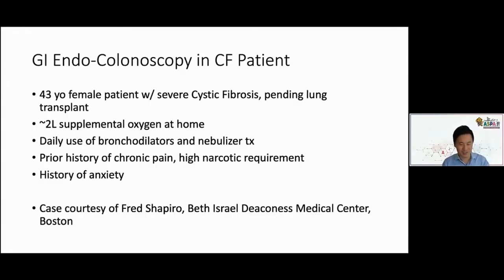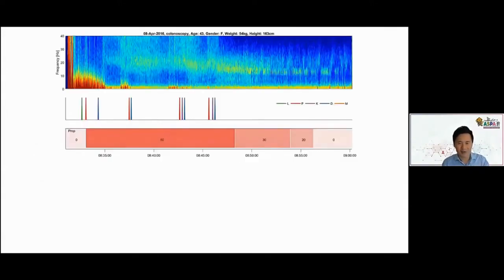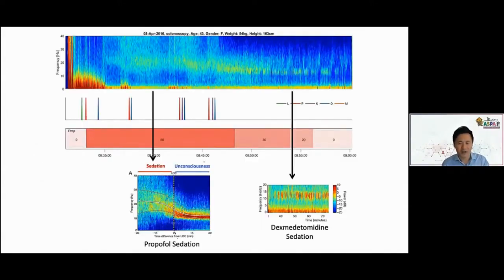So that's really tough. In this case, what happened was, I'll quickly fast forward. Fred used a propofol infusion of 50, 30, and then 20 mics per kilo per minute to produce sedation. He was giving little boluses of dexmedetomidine, in blue here, along the way. And then at some point, of course, over a 25-minute period in total, end to end.